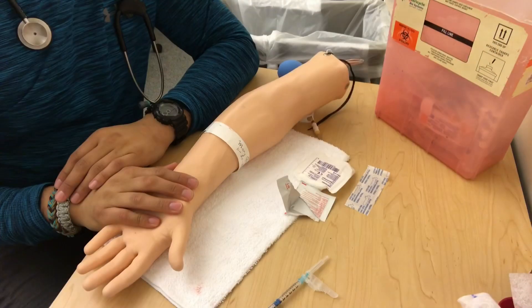In this video, we're going to talk about ABGs — arterial blood gases — and try to cover everything we can about them. We'll start with equipment, go to technique, and then cover my five tips for success. Alright, so we're all ready to go.